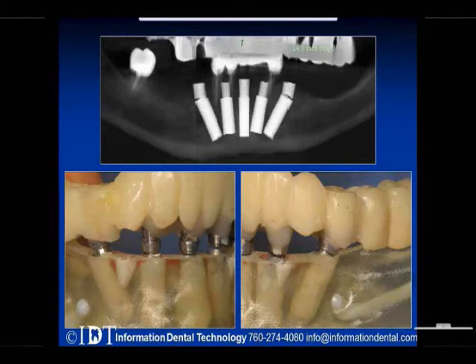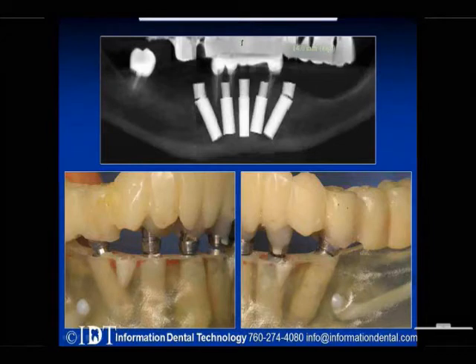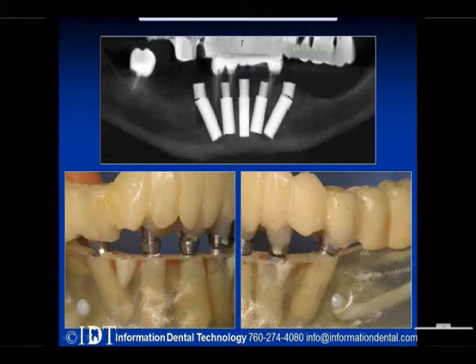And then this is the final outcome of that. You'll notice these would be tough angles to get if you were freehanding versus using a surgical guide for a case like this. So it worked out really great. And what we did on this case is immediate temporization. We used a model and did the entire surgery on the model, and then we prepared the temporaries off of that.